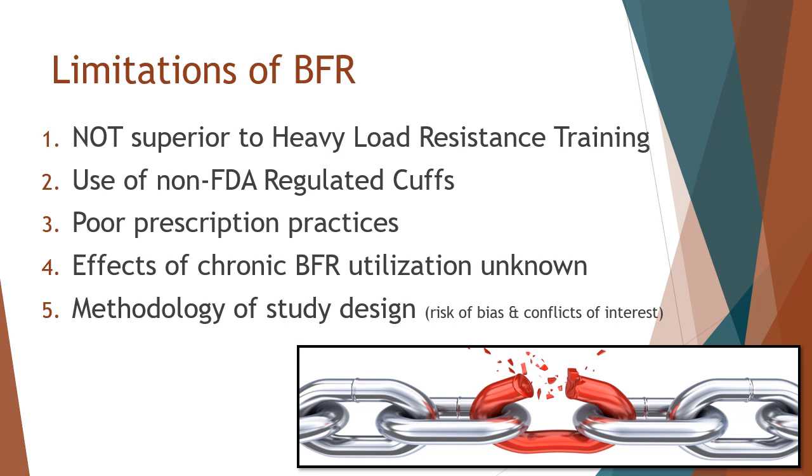regimen. The effects of chronic BFR, right? It's relatively new as far as its ubiquitous use, even though Kaatsu training has been around since the 1950s. With the practical and the more current concepts and methodology, where they've done it for an extended period of time in a much more structured and regimented way, we don't necessarily know what the long-term implications potentially could be. All to date, the short term, we'll call it 3 months or longer, or within that 3 to 6 months, have all shown to be beneficial. But if someone uses this chronically for 30 years, that information is still unknown.